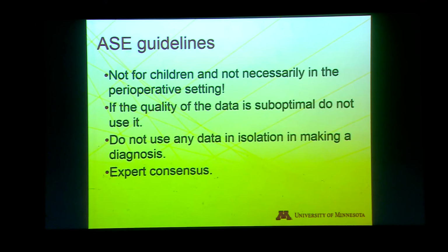So in the perioperative setting, this is something you need to remember. It's not for children, and this is the wording exactly from the guidelines, not necessarily in the perioperative setting. And we are talking about diastology in the perioperative setting. And these are the best guidelines we have out there. And if the quality of data is not optimal, don't use it to make a decision. And do not use any data in isolation. That's just good practice. And these guidelines are based on expert consensus. There is no hard evidence for this.